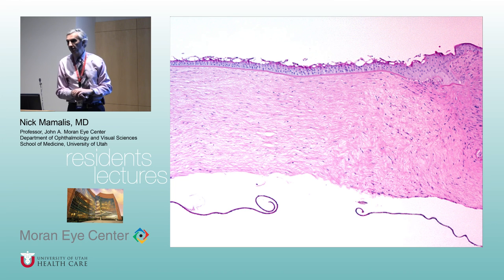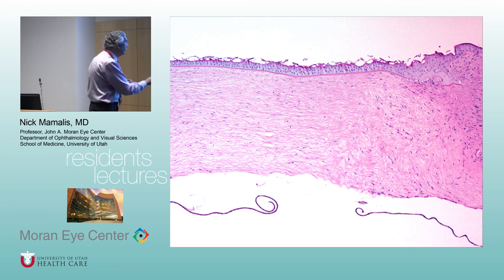So the endothelium isn't really attached to that Descemet's? Yes. So there are cells there that are part of it? They're right here. These are actually endothelial cells right there, those little tiny dark dots.